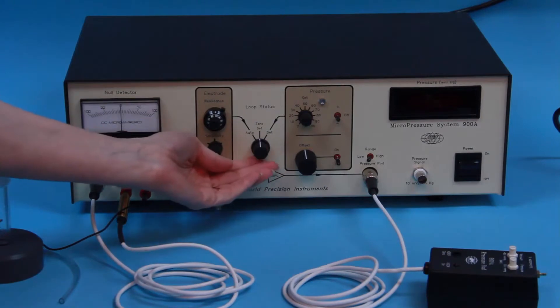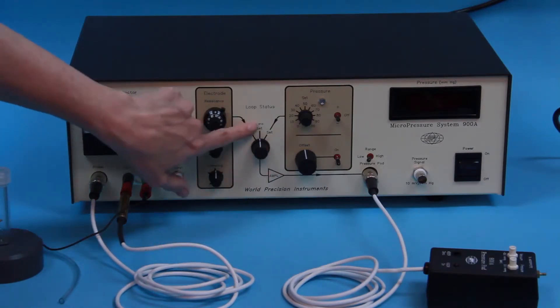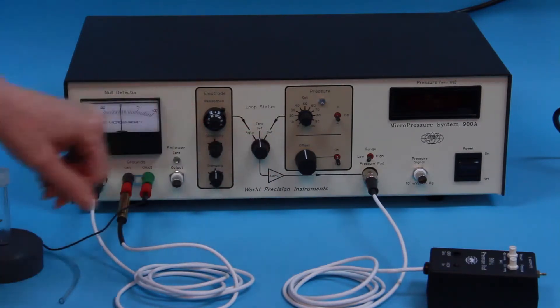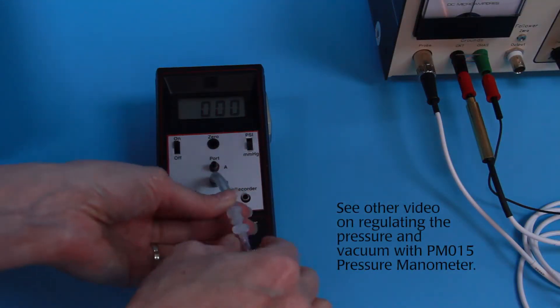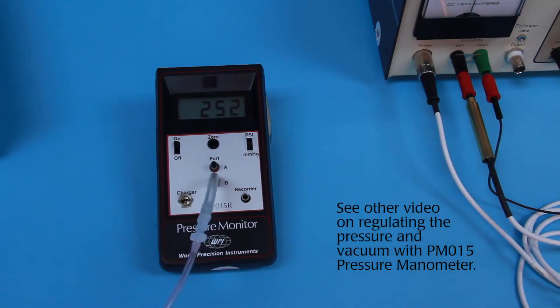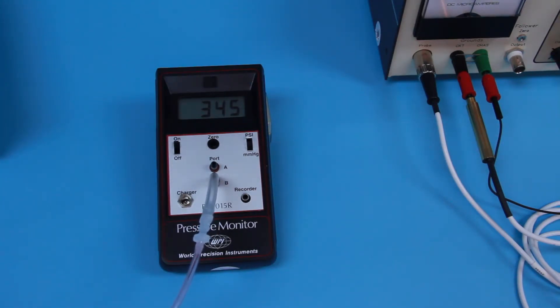Then we need to re-zero after pressure and vacuum are applied. Make sure the system is still in zero set mode. The sources of pressure and vacuum for the 900A pressure pod should be regulated to approximately plus 350 millimeters of mercury for the pressure and minus 150 millimeters of mercury for the vacuum.